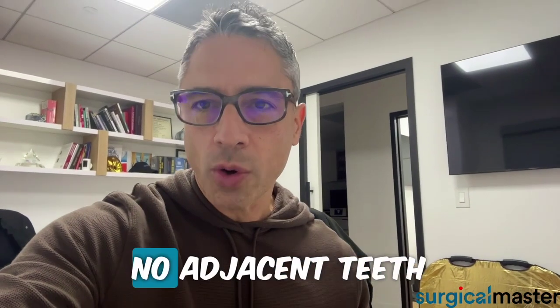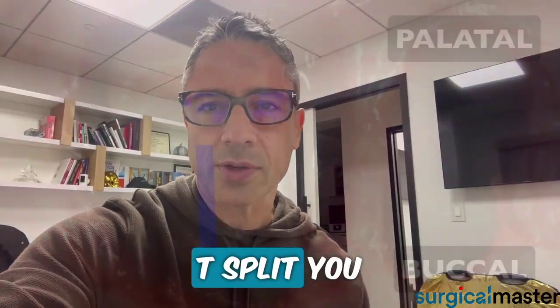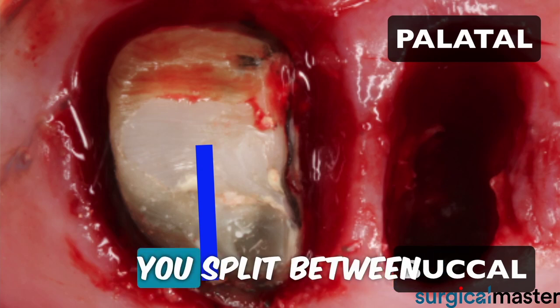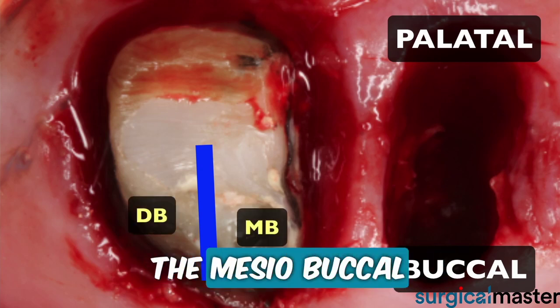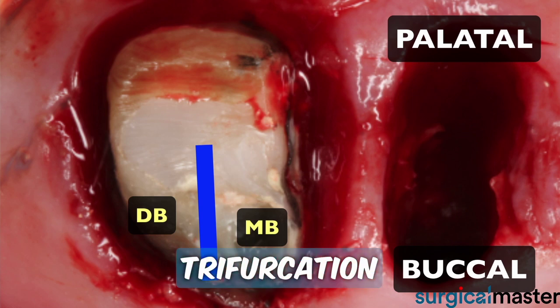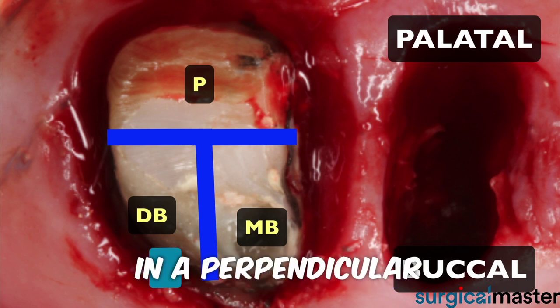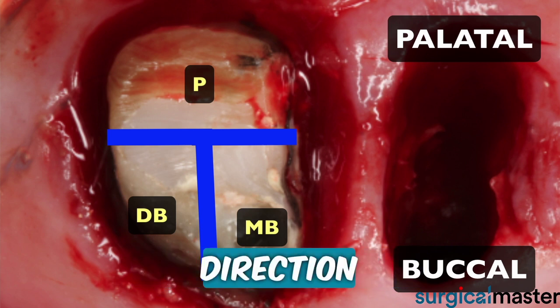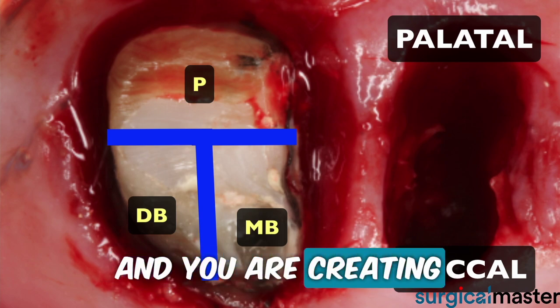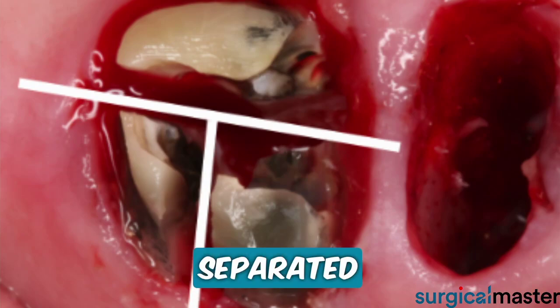If there are no adjacent teeth, then you can choose a T split. You start the exact same way — split between the mesio-buccal and the disto-buccal roots — and at the trifurcation, you continue at a 90-degree angle in a perpendicular direction, creating the shape of the letter T. And voilà, the roots are separated.